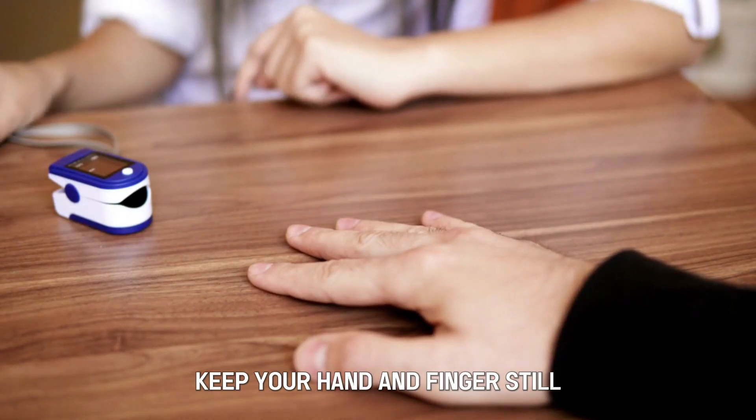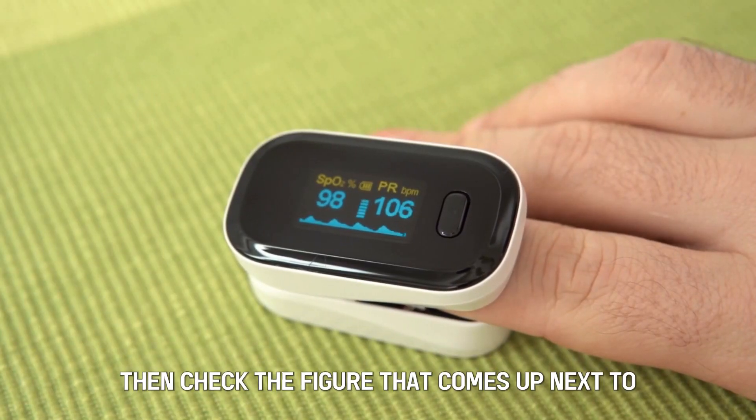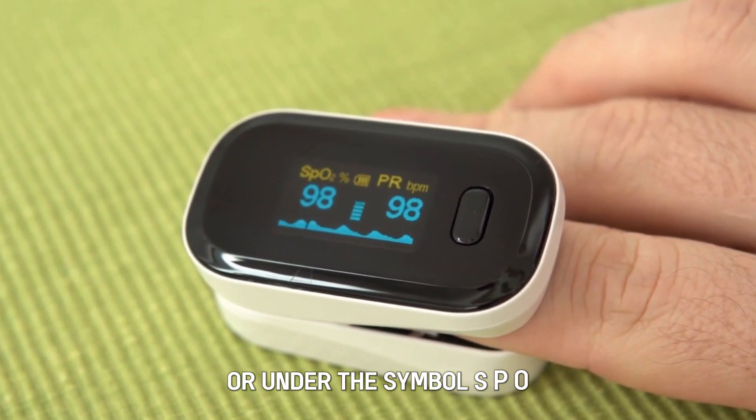Keep your hand and finger still while breathing normally. Wait for about a minute, then check the figure that comes up next to or under the symbol SPO2.